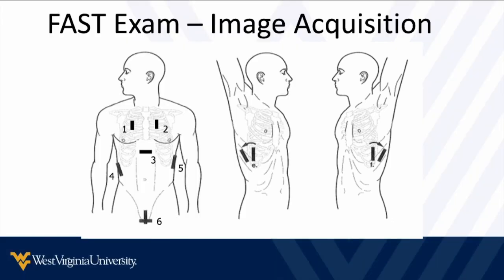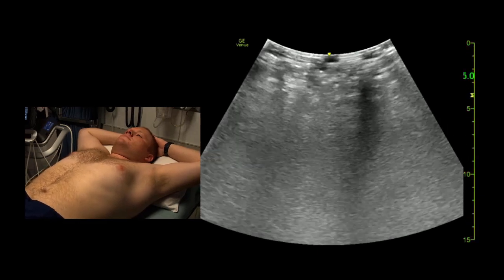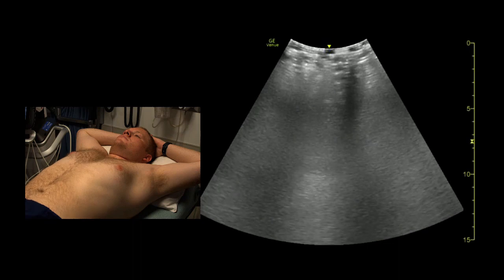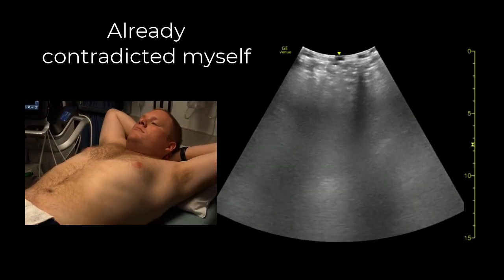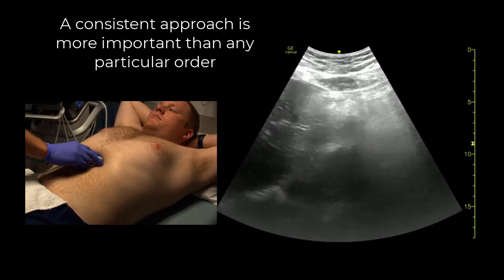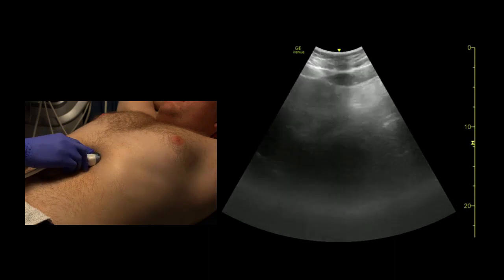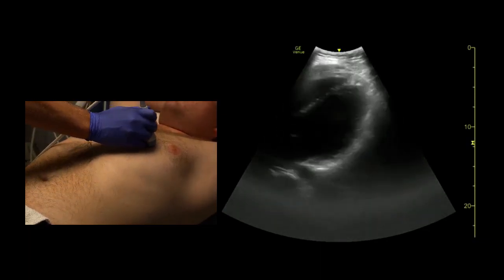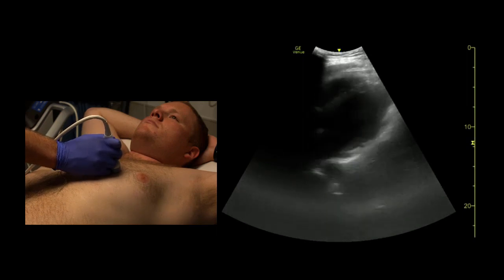Let's watch a quick demonstration of the FAST exam and normal findings. We want the FAST exam to be quick — no switching probes, so the whole thing is done with the abdominal probe. I usually start with the heart. With the abdominal probe in an abdominal setting, indicator towards the patient's right, we place it right under the xiphoid. We ask the patient for a big breath and hold. We can see the heart well enough to confirm there's no pericardial effusion. If that view isn't adequate, pick up the transducer and find the heart in the parasternal position — we're just looking for effusion and whether the heart is beating. No other detail needed.